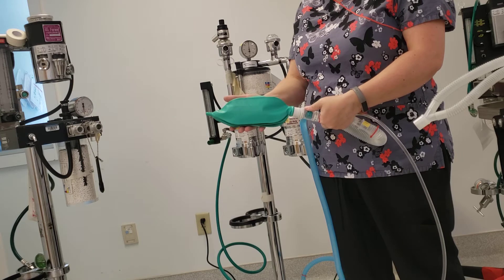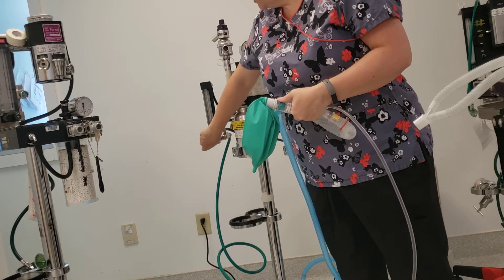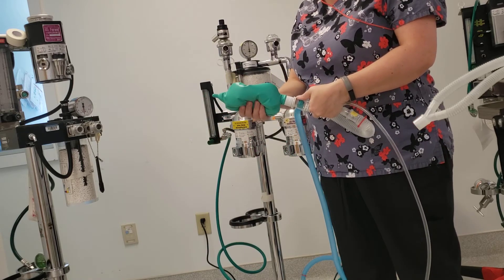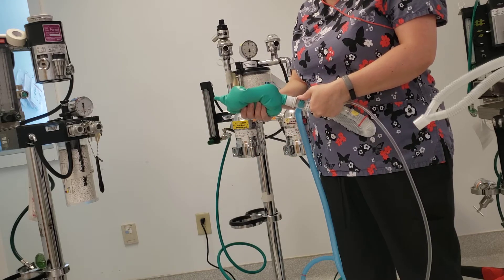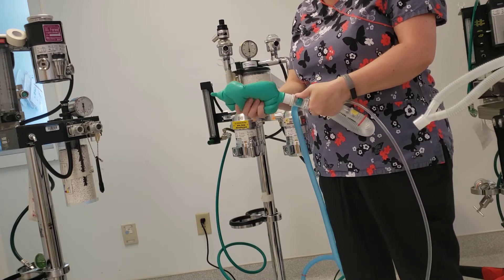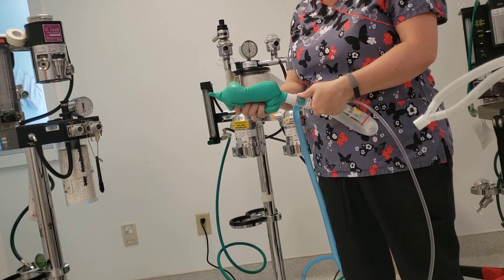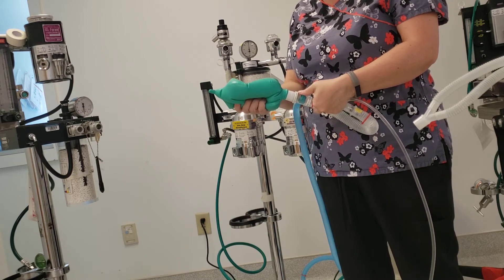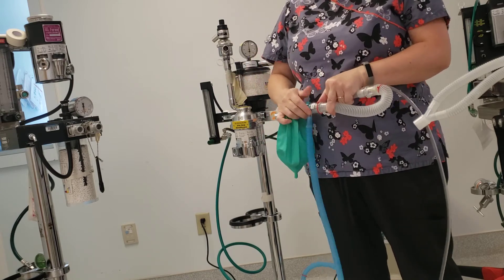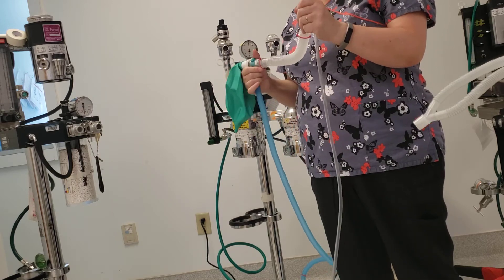I just want to make sure I can give a breath. I'm going to turn off my oxygen and put a little pressure on here, and make sure that it holds pressure. I want to be able to squeeze this bag and actually give a breath to my patient. Since this can actually hold the air into it, I'm going to count this as good. I'm going to open my pop-up valve, release the pressure in it, and take my hand off the patient end.